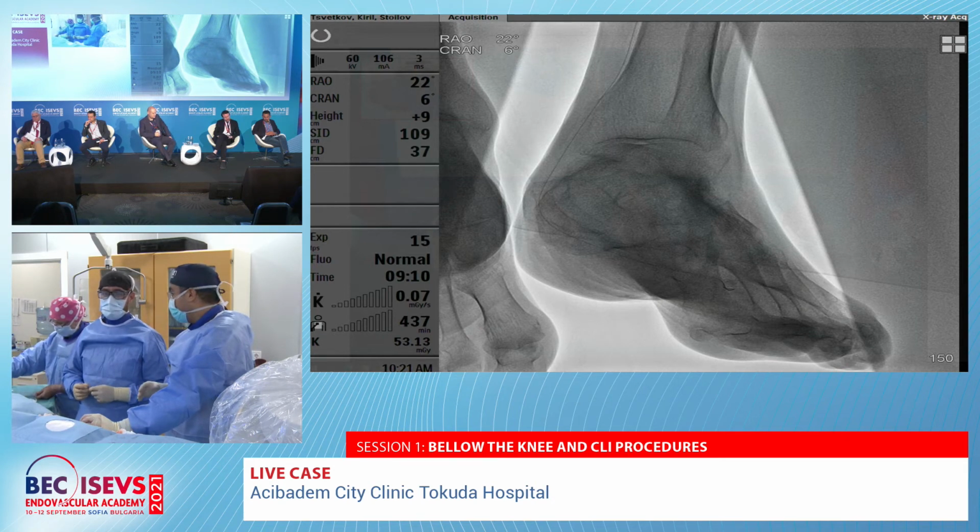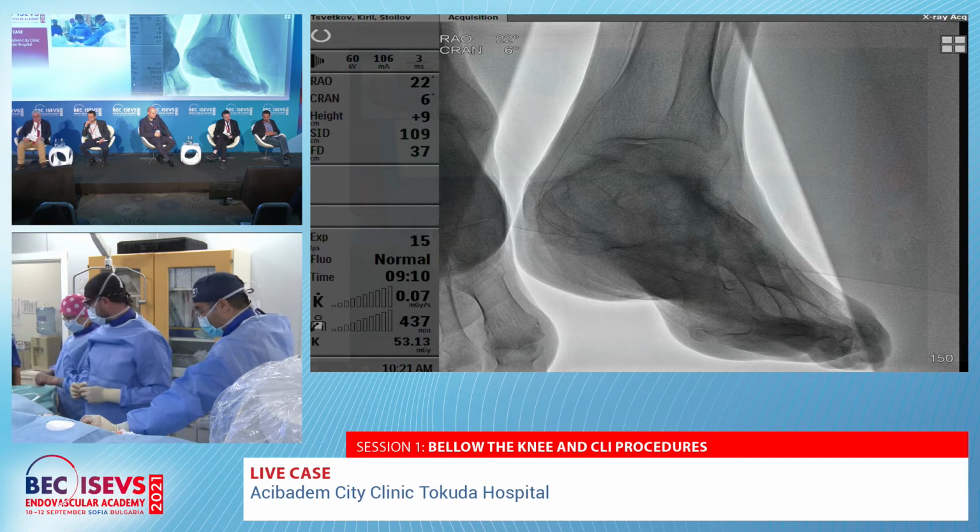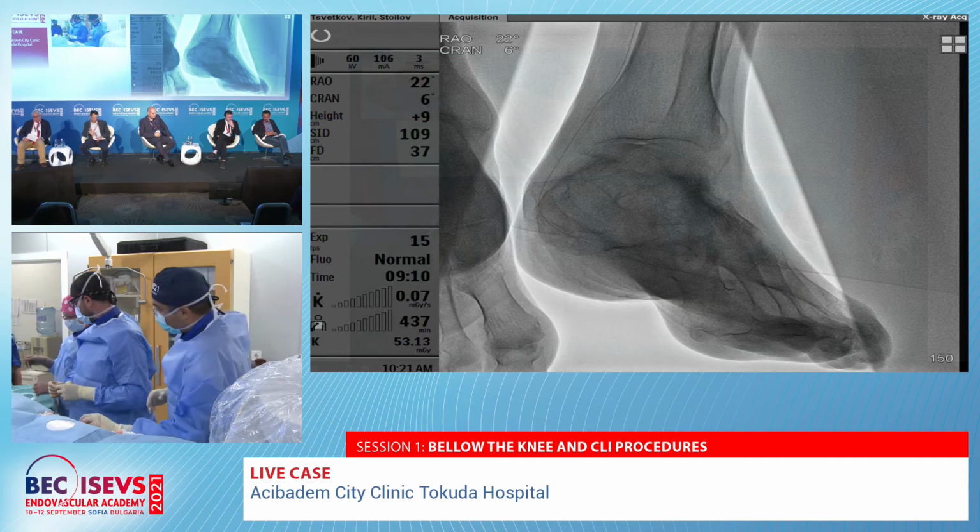It's time to assess the efficacy of Paseo 14. Exactly. Yeah. So let's see what Biotronik says, if this really has good trackability.